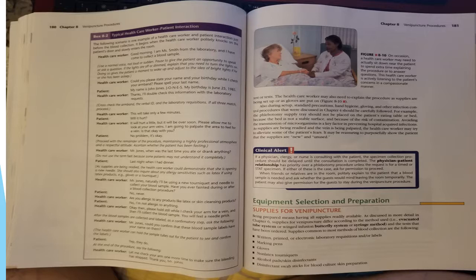The healthcare worker may also need to explain the procedure as supplies are being set up or as gloves are put on. Also during setup, standard precautions and hand hygiene, gloving, and other infection control procedures that were discussed in Chapter 4 should be carefully followed. For example, a phlebotomy supply tray should not be placed on the patient's eating table or bed because the bed is not a stable surface and because of the risk of contamination.